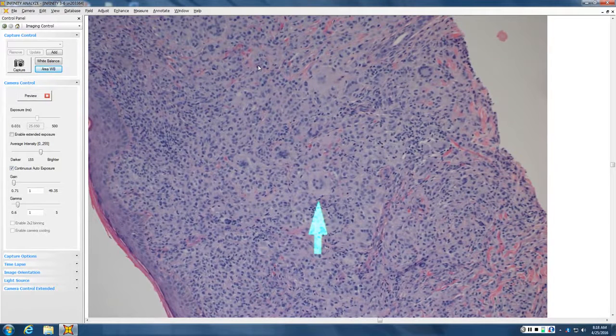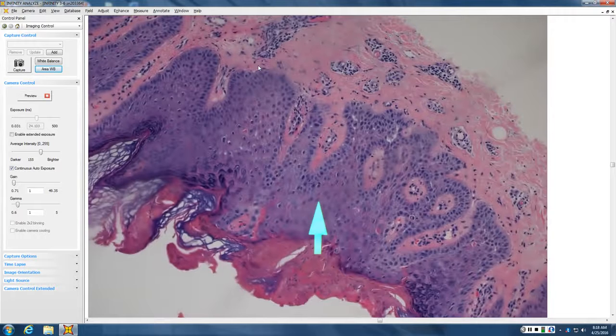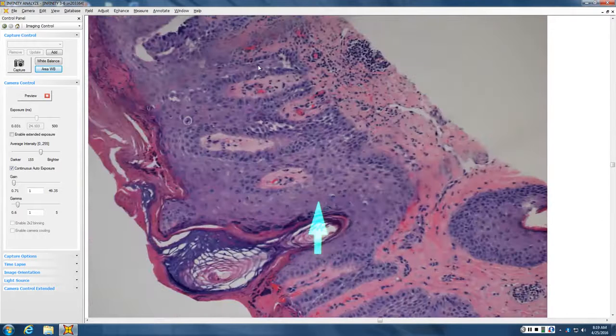That's kind of the life of an XG. You can say JXG if your patient is J, but your patient isn't always juvenile, so then it's just a xanthogranuloma. So if your patient's not J, it's just an XG. J at heart. Many of us are J at heart.